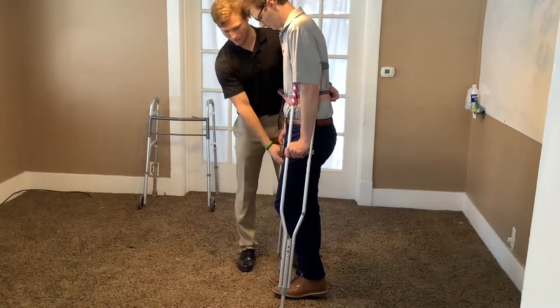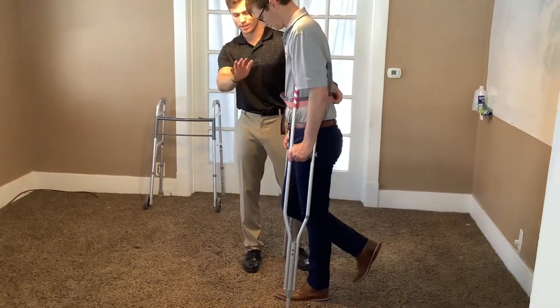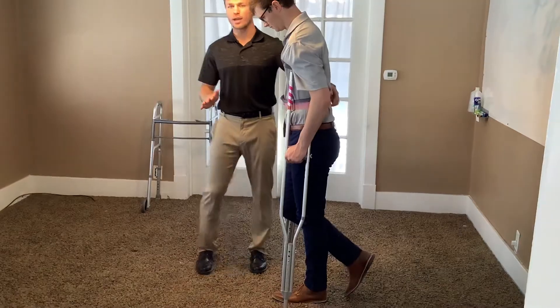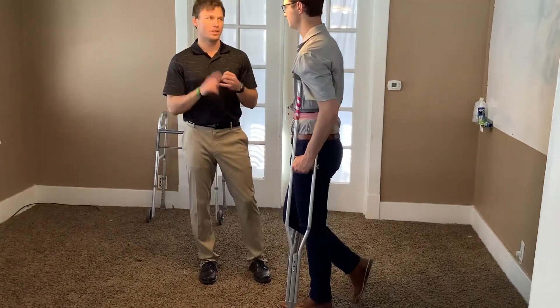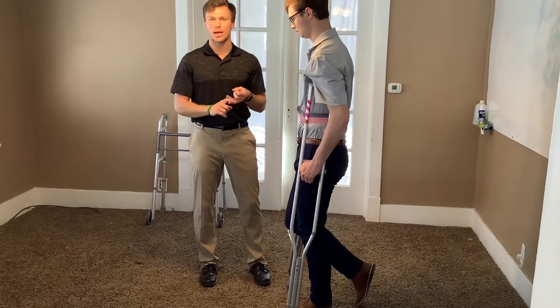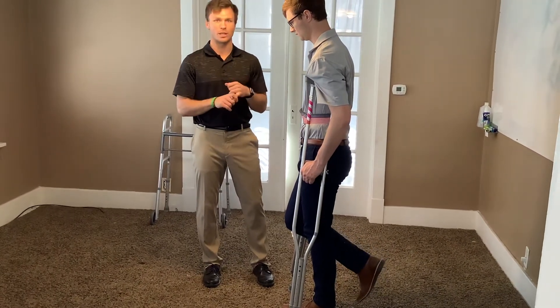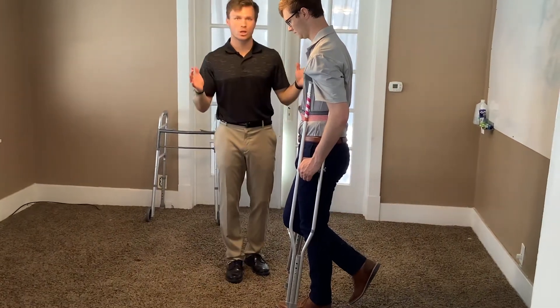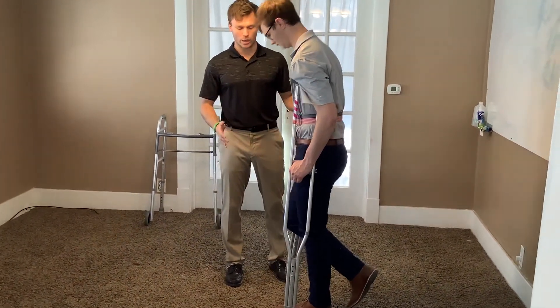I'm already on the right side so they can still see you. Now, for the three-point modified, the only thing that changes is that the patient can now be partially weight-bearing — toe-touch weight-bearing or weight-bearing as tolerated.